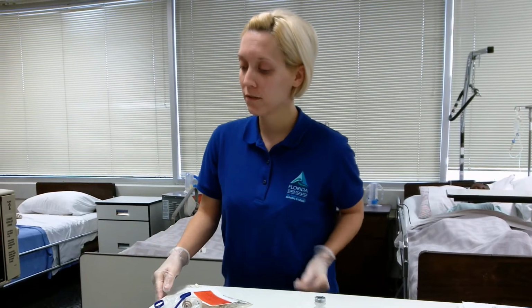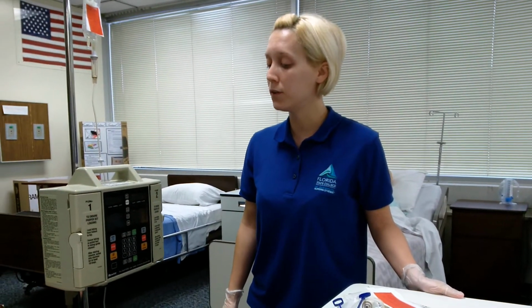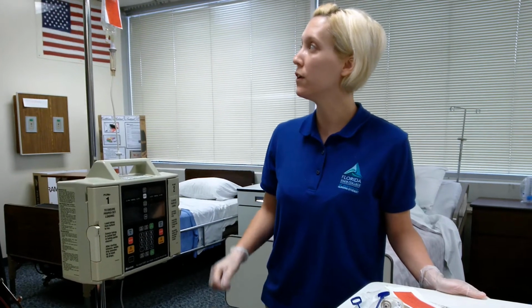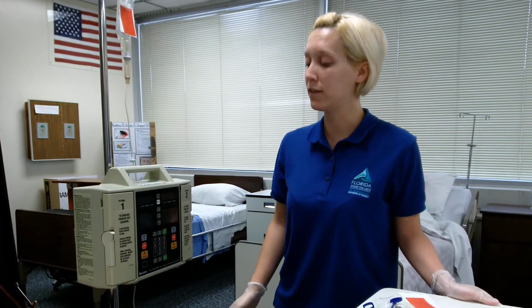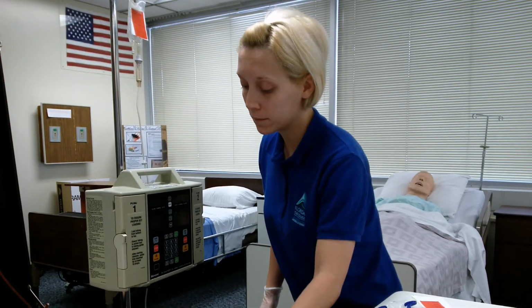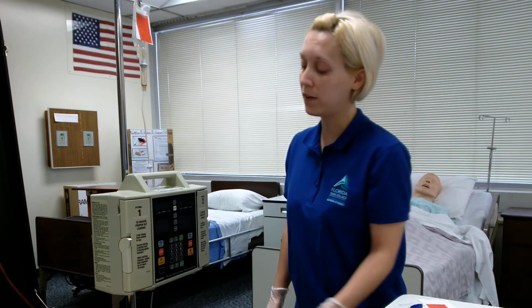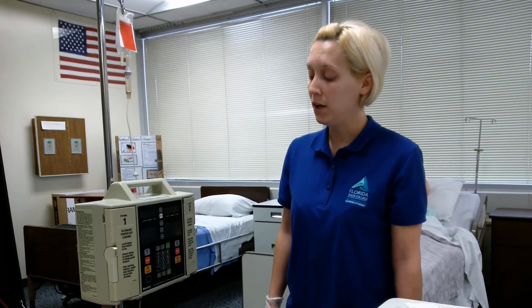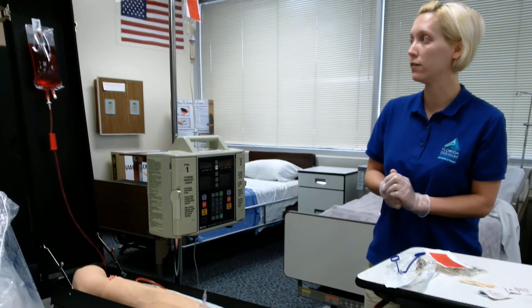Mrs. Jones, I'm Alex. I'm a student nurse. The doctor has ordered for you Rocephin, which is an antibiotic, which we're going to hook up today to hopefully reduce the inflammation and get rid of that infection. Can you please confirm your name and date of birth for me? And can you tell me if you have any allergies to penicillin or anything? No? Okay. I'm going to wash my hands and put on clean gloves.